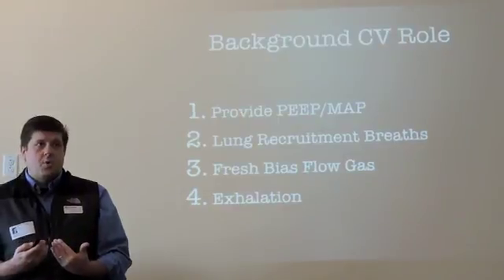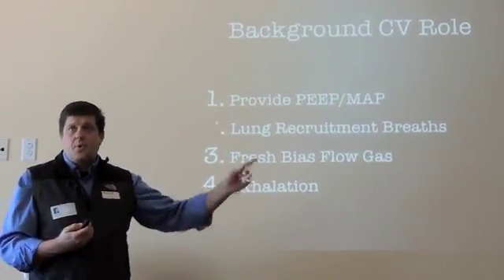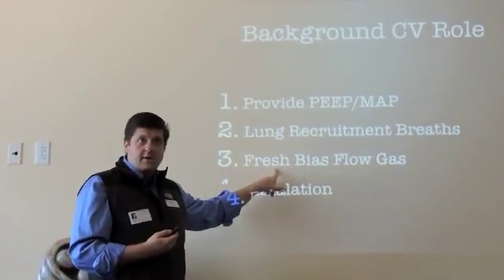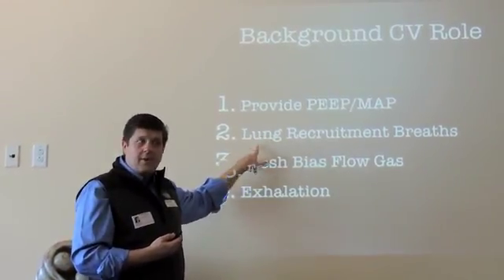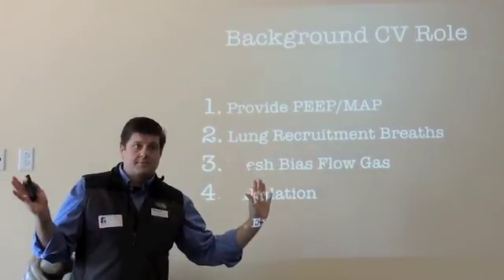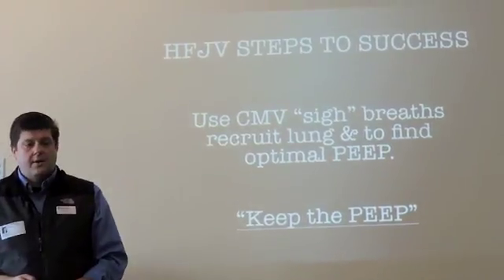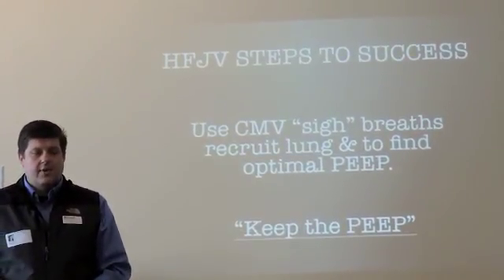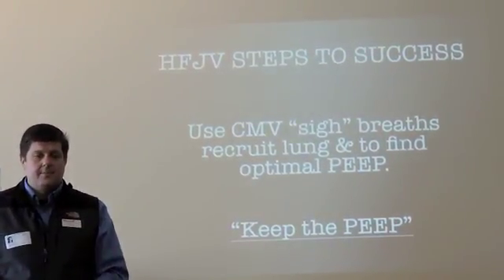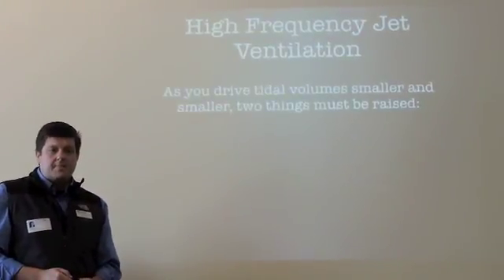How successful you are with the jet is very much determined by how successful you are at using the conventional ventilator. If the airways aren't open, if we don't have optimal PEEP, if we're not doing all this stuff, then the jet's absolutely worthless, okay? So there's a big emphasis on using the conventional ventilator appropriately to get the job done. And I think it all revolves around finding this optimal PEEP.